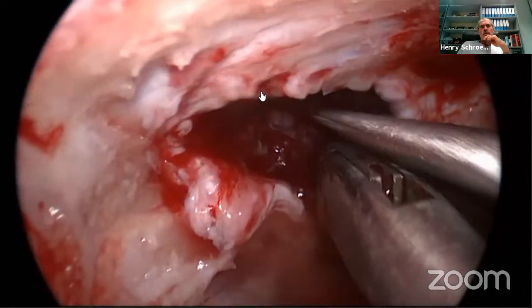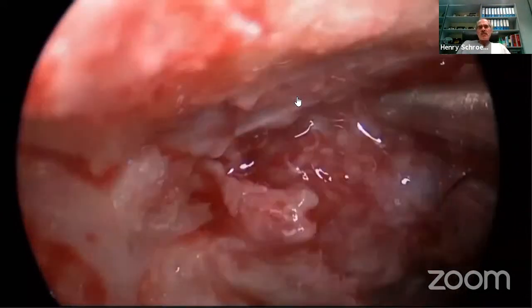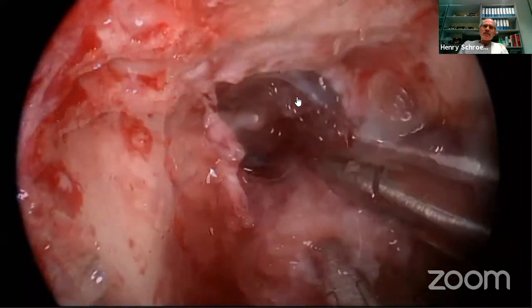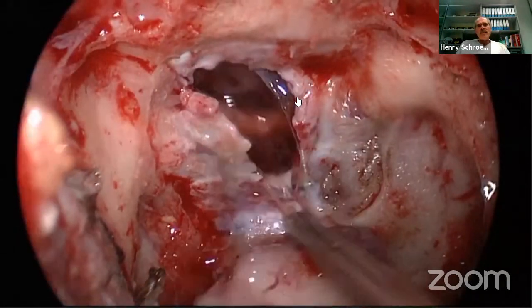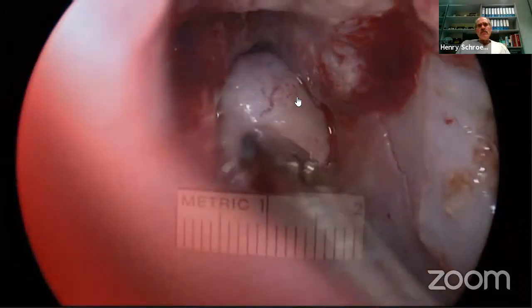And then you see the tumor has a good arachnoid plane, it was an easy dissection by manual dissection, not simply pulling. Look around, dissect the arachnoid by manual dissection as we used in the microsurgical transcranial approaches. Tumor is removed.